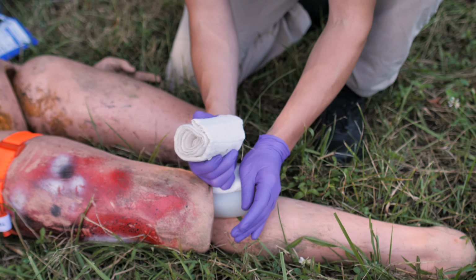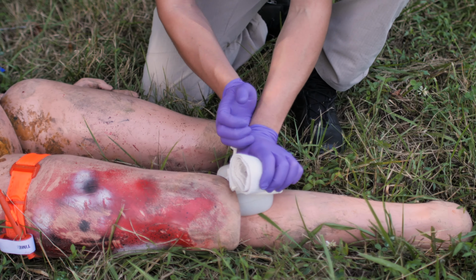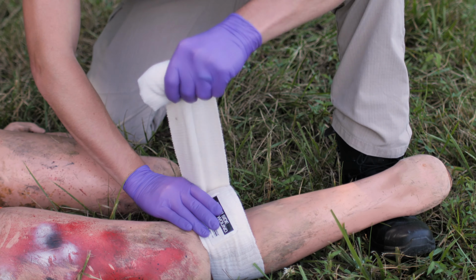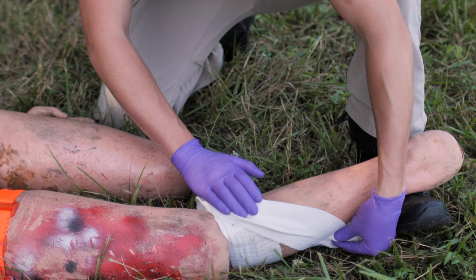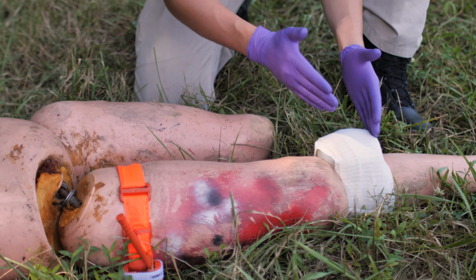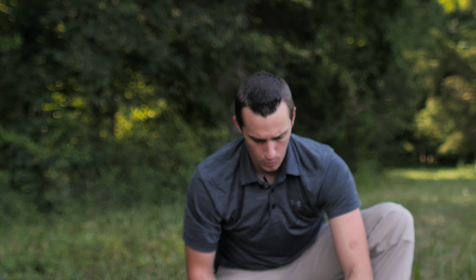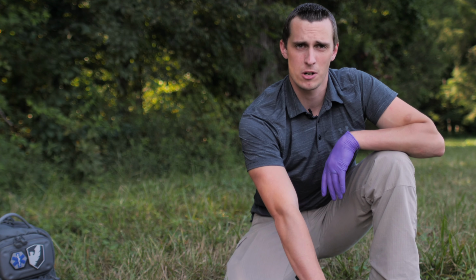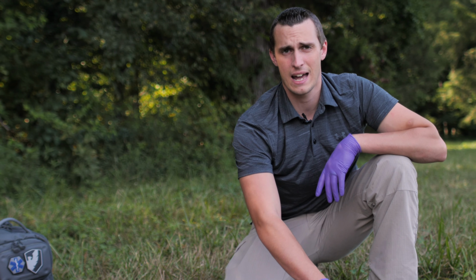But now I'm gonna take my pressure bandage, place it over the wound, and now I'm gonna start wrapping this around it. First wrap's gonna be fairly loose to hold it in place, and then I'll get it tighter as I go. Okay, so now we have the wound packing in place. We have a pressure bandage on top of it, so we know that this is pretty well secured. So now we can go ahead and start releasing this. Again, there should not be much bleeding, so it should be pretty easy to pack that.